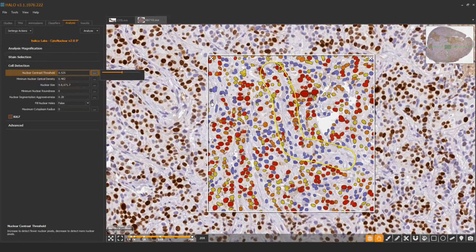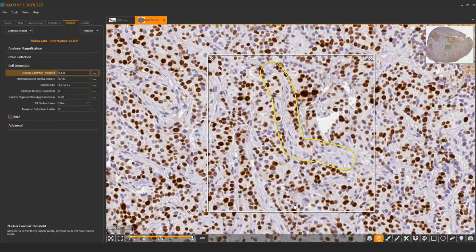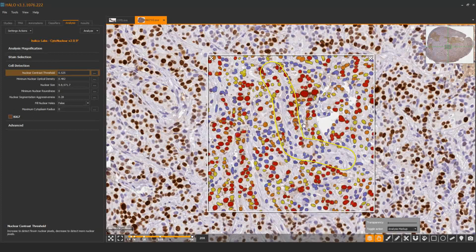You can also segment on the basis of contrast. So let's turn the real-time tuning window off. And we'll just look at an example of a high contrast object relative to a low contrast object. Here you've got a cell which is very intensely stained. It also has a sharp border between the background and the nucleus itself. Correspondingly, you've got some other objects which are very diffuse. Maybe the nucleus is damaged, or the nuclear membrane is ruptured, or it's within a high background area. There isn't a great deal of contrast between the nuclear object and the background. So what we would do here is really use a contrast threshold in order to find those objects which are very diffuse. So we may need to reduce these options down. And you'll see how the markup changes again and more cells are included.